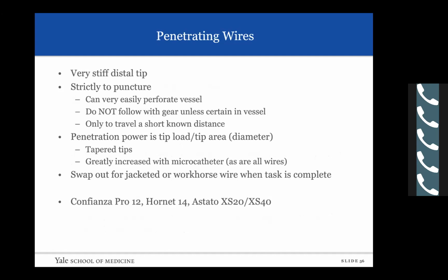Penetrating wires we talked about have a very stiff distal tip. This is only to puncture. These are not to traverse long segments of vessel. And once you've done the job, please swap these out. These will easily go through the sidewall of a vessel without much sensation or pop, especially the tapered tips like the Confianza Pro 12 and the Hornet 14. Remember that your tip force is related to the tip load over the tip area. So if you have a 10 gram wire, but the tip area is half, your force is much greater. It's the difference of being stepped on in a sneaker or a stiletto. And again, swap these wires out. These are the ones that we have in our lab, the CP12, 14, and the XS20 and 40, which hopefully we will get shortly.